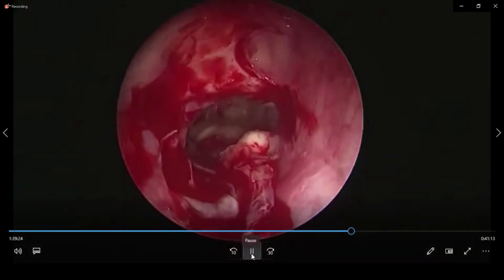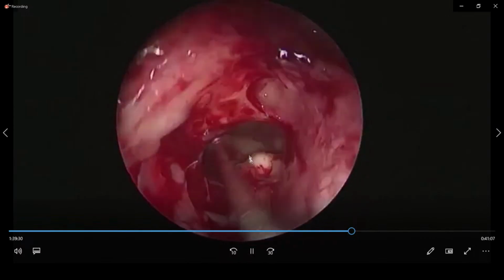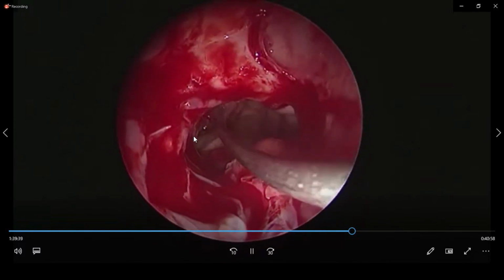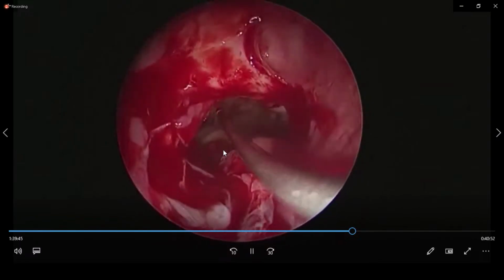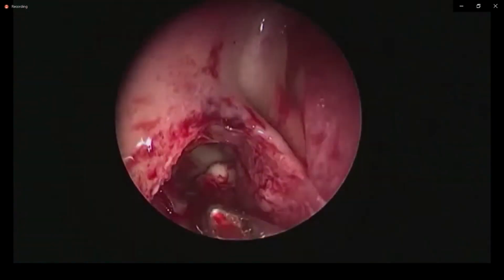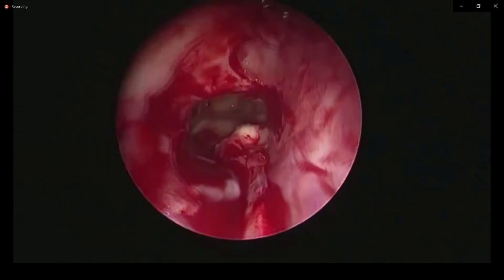See this? The frontal sinus drainage pathway with the 70 degree scope, this is the beak, this is the middle turbinate laterally, and more party wall coming out to widen the frontal sinus drainage pathway. So, we cannot measure in centimeter, we should continue until we remove all septations to flush the frontal sinus completely to its limits. If you leave the septations, the mucosa can grow along and can re-stenose. If you flush to the limits, the re-stenosis can be more efficiently prevented.